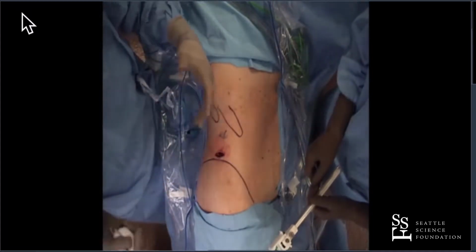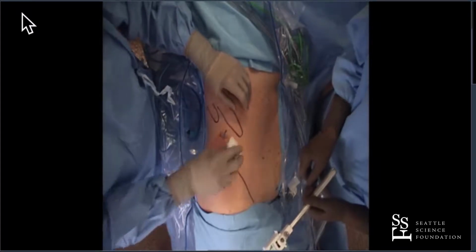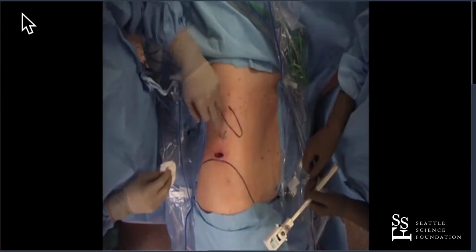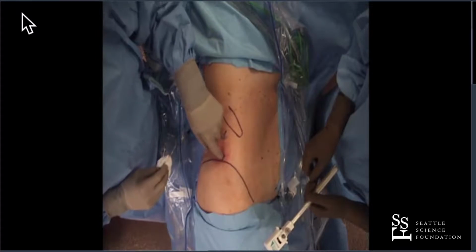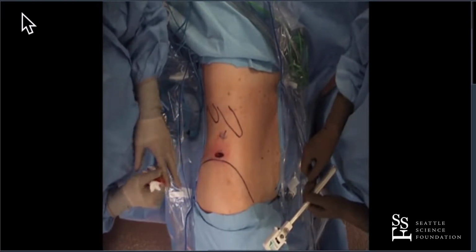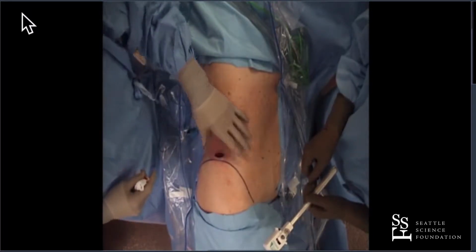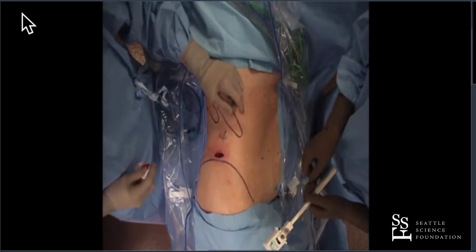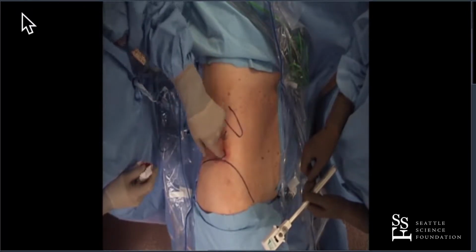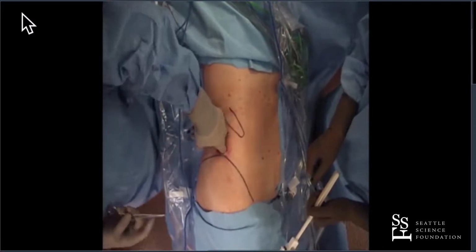Now, the XI allows that, because the XI does have the ability to go backwards on itself, and I'm going to show you why that's important. But in most cases, you want to be as low as possible so that you can get to the lower pole. The lower pole tumors on the right are actually the hardest because of where we are. And so I always want to cheat back as close to the iliac crest as possible. That's what we found to be important. Anyway, I make my incision.